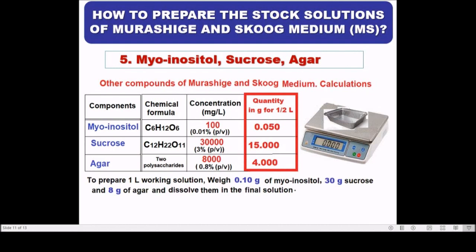To prepare the working solution, add 0.1 gram of myo-inositol, 30 grams of sucrose, and 8 grams of agar and dissolve in the final solution.